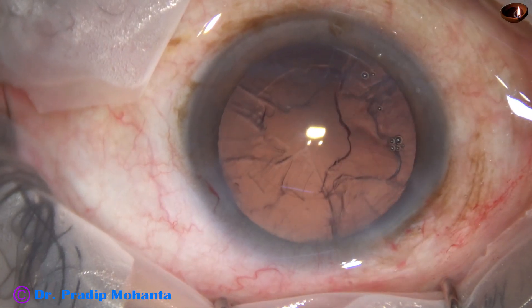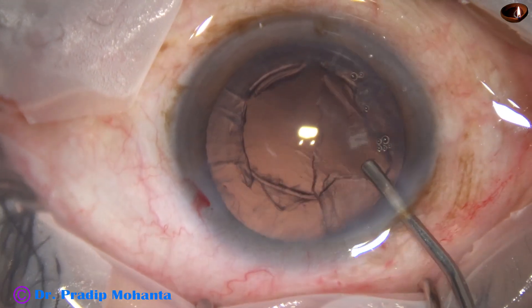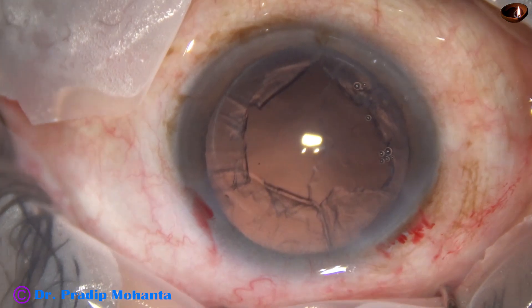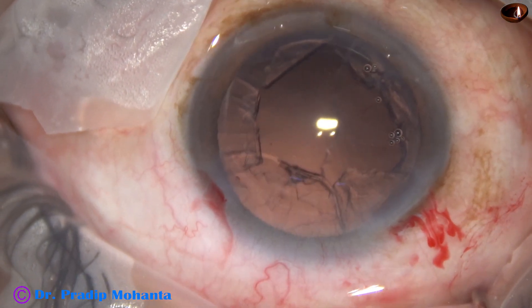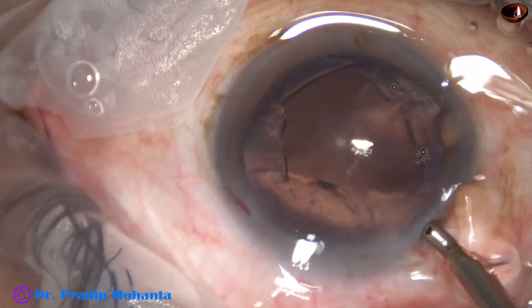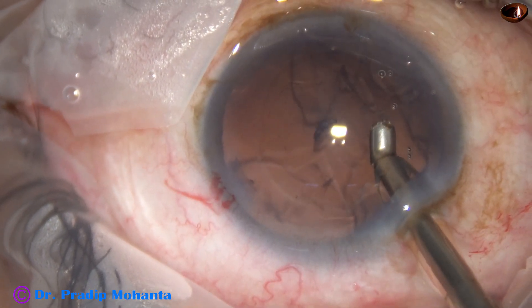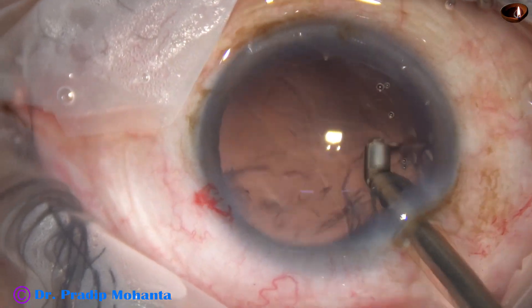In this case, I am going to use a coaxial irrigation aspiration device. The machine being used is the Alcon Centurion, and the microscope is Alcon. I have no financial interest in any of the equipment or lenses mentioned in this surgery.